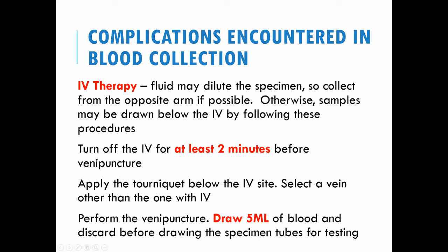So again, the 5 ml of blood is to remove the excess medicines or the contaminated blood. So we need to have a 5 ml discard tube so that by the time we insert the tubes used for testing, they will get a fresh blood sample.